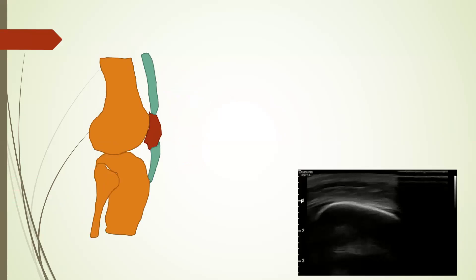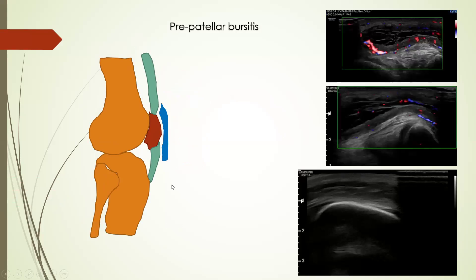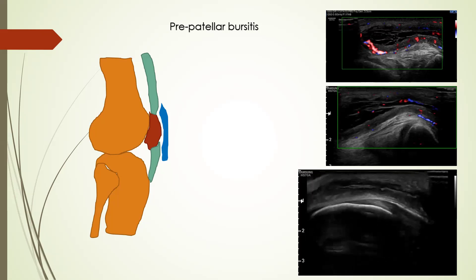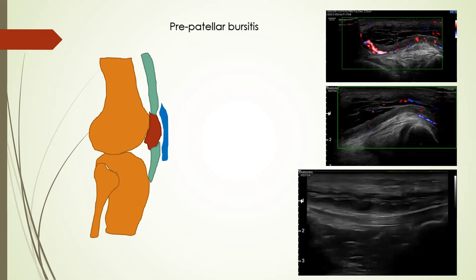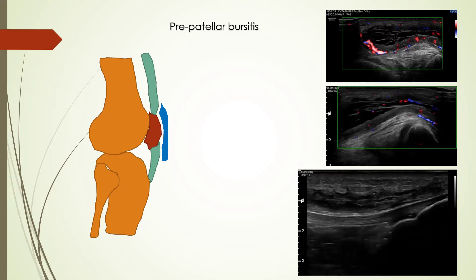The most common pathology in the extensor compartment is pre-patellar bursitis, which is basically distension of the adventitial bursa located in the subcutaneous plane anterior to the patella and the patellar tendon. These still images show distension of the pre-patellar bursa surrounded by thickening with increased vascularity, and this video shows distension of the pre-patellar bursa leading to pre-patellar bursitis. It occurs because of constant friction in this region.